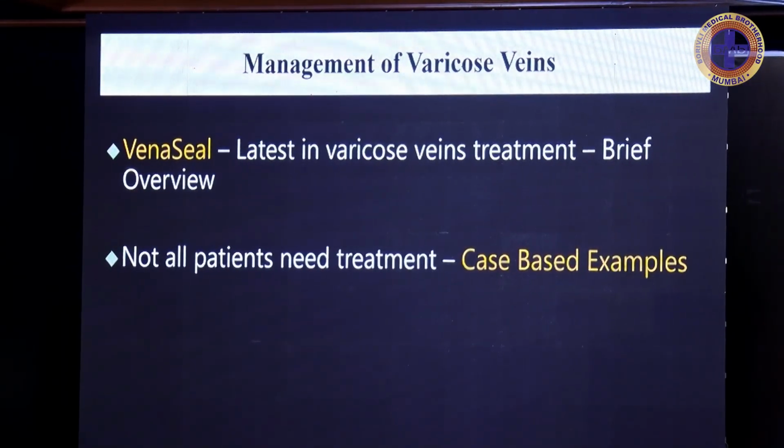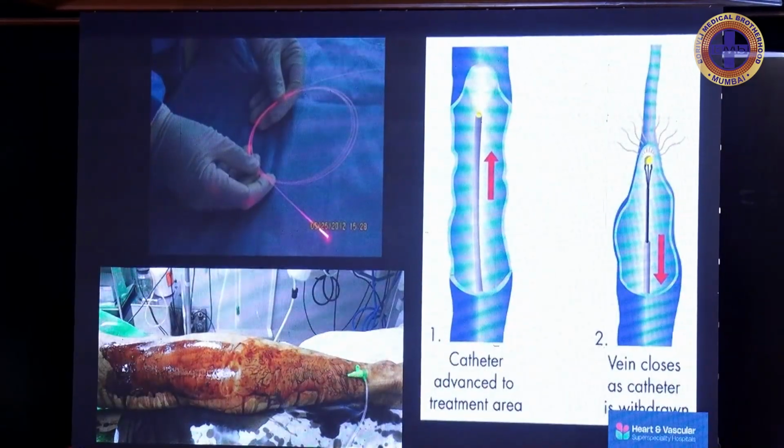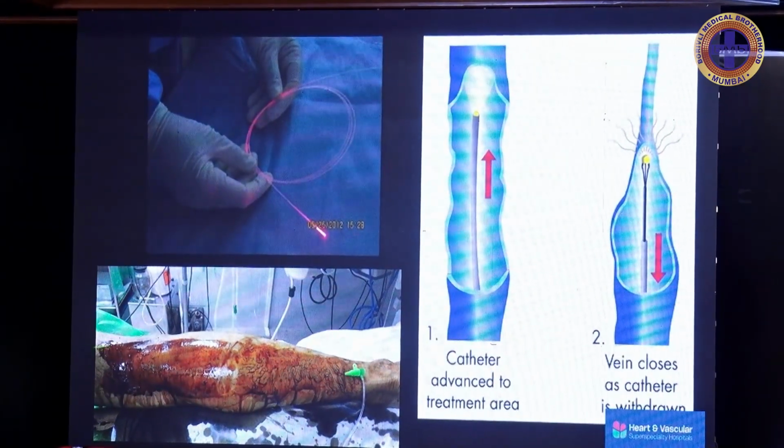So VenaSeal is the new kid on the block, and when not to do varicose veins treatment. So before that, just to show you, this is how we do a standard EVLT.